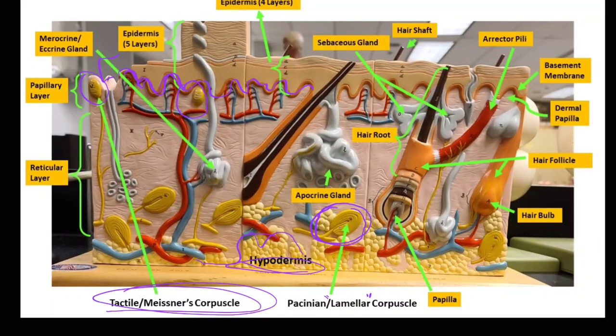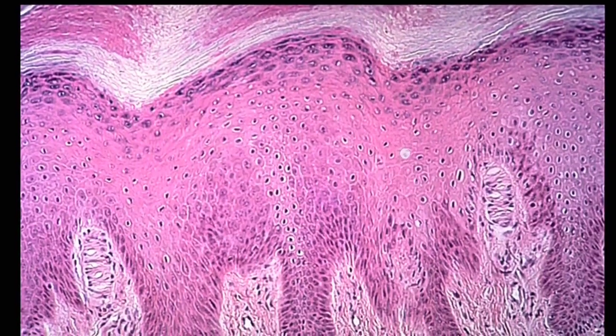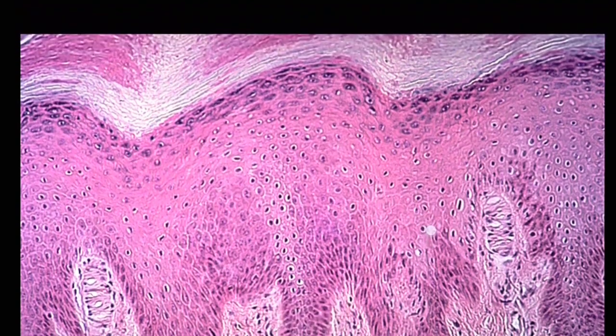Let's take a look now at some histology of these receptors. These images are images I just pulled off of Google, so you can do the same when you're studying. You can find labeled or unlabeled images of all the histology that we are talking about today, or our modules also have some good examples. So any of these are good candidates for PowerPoint questions.